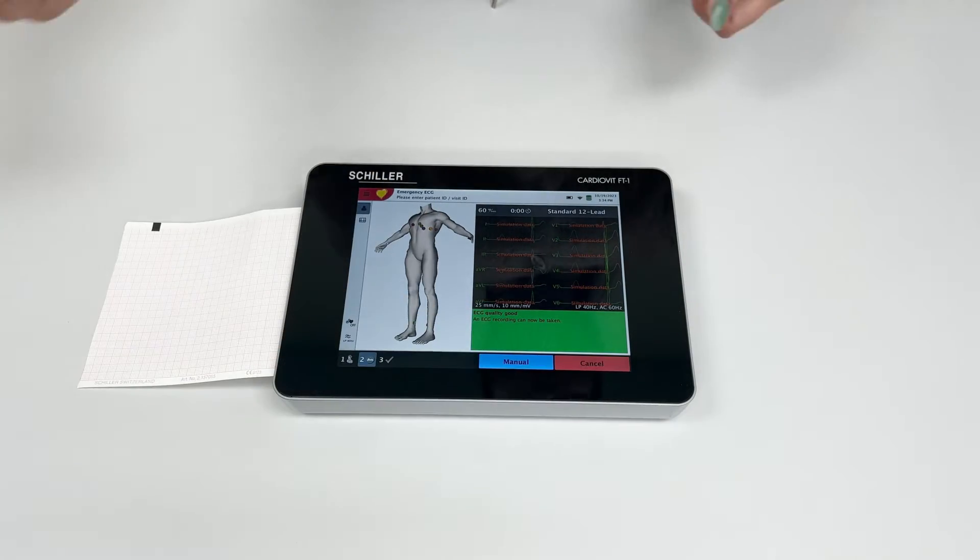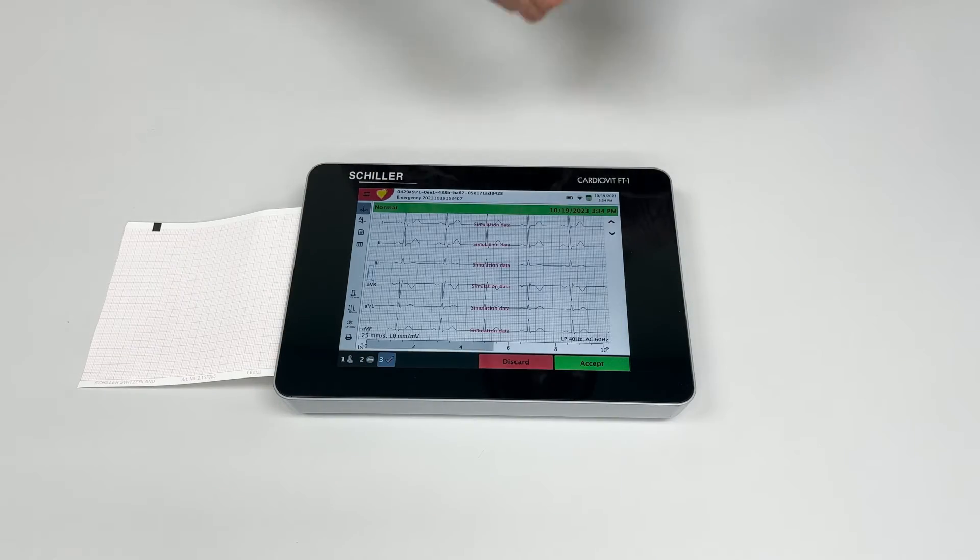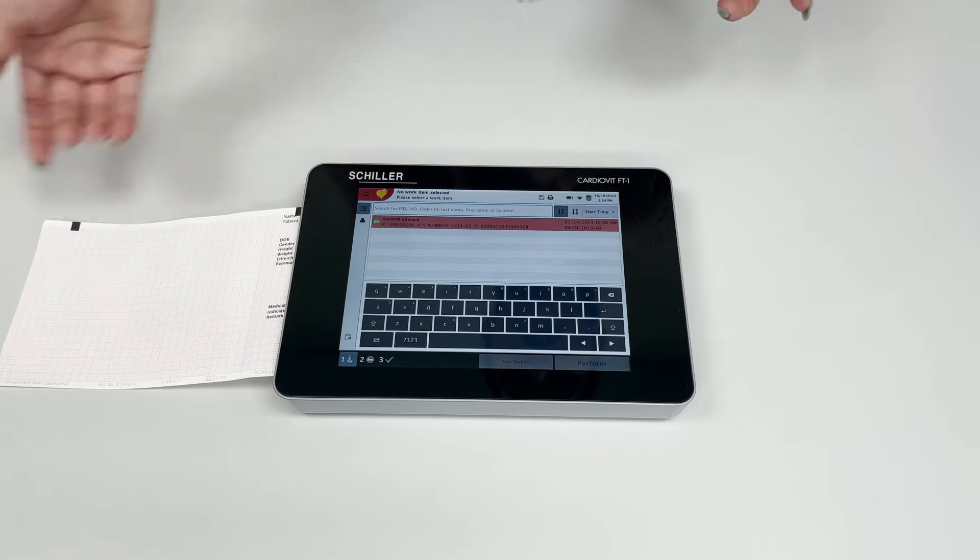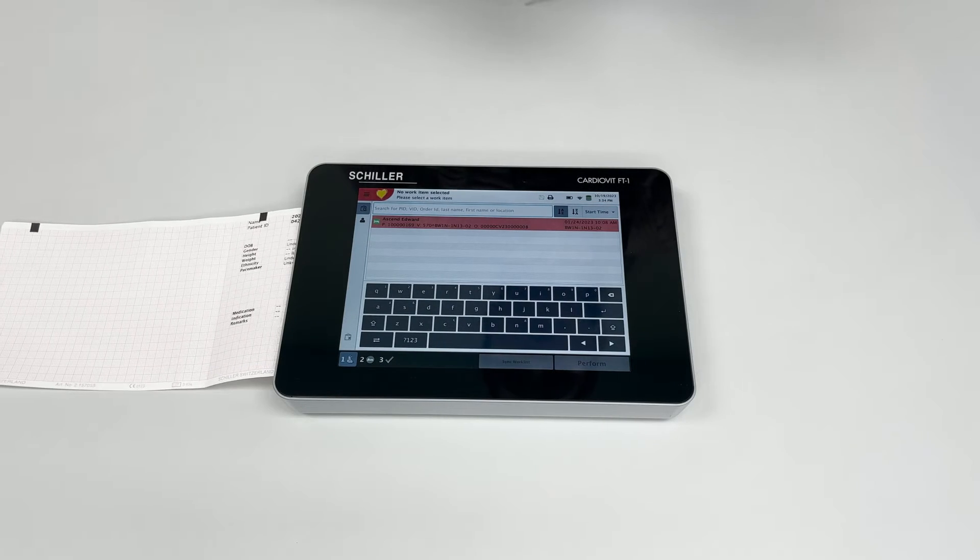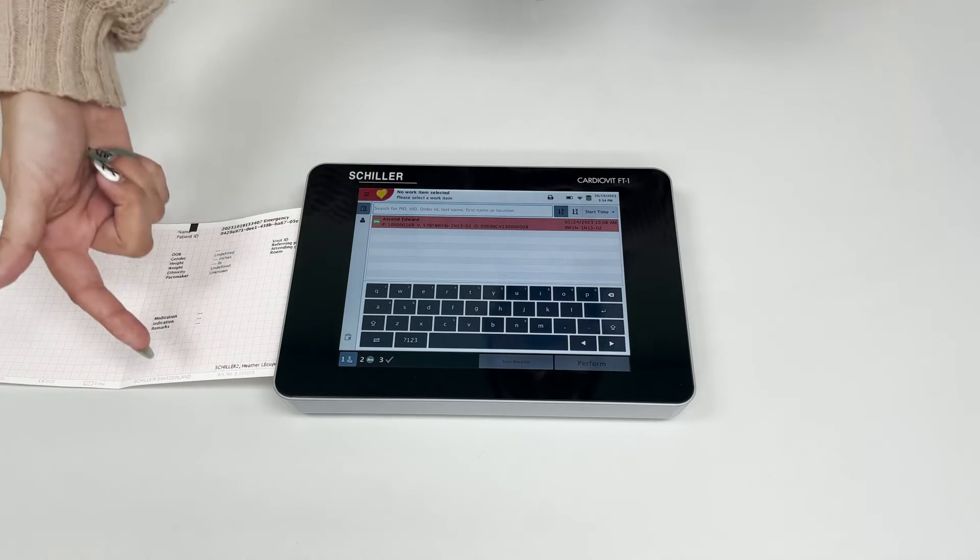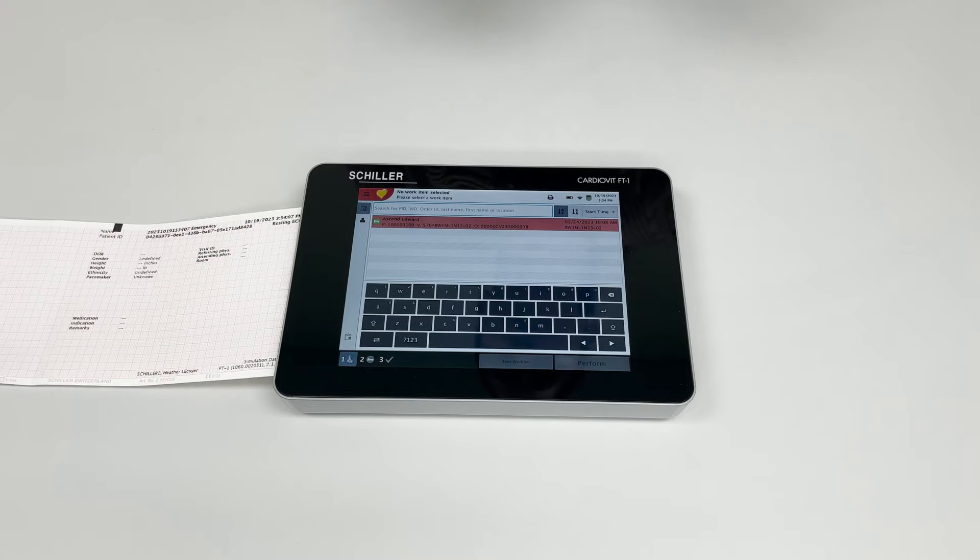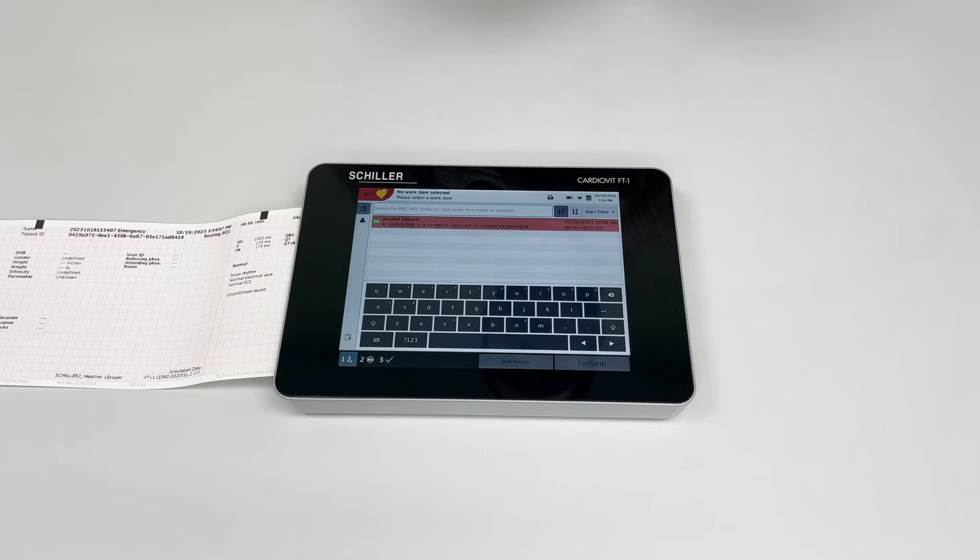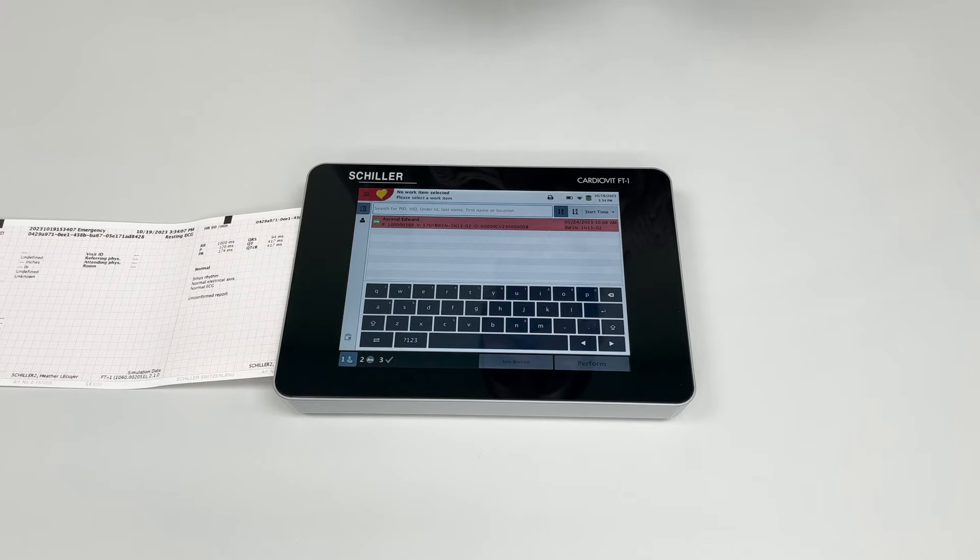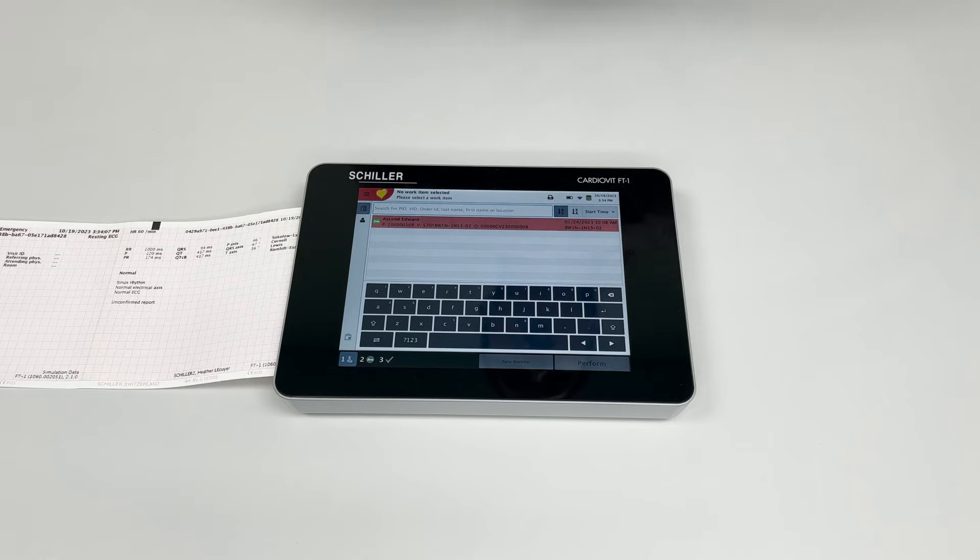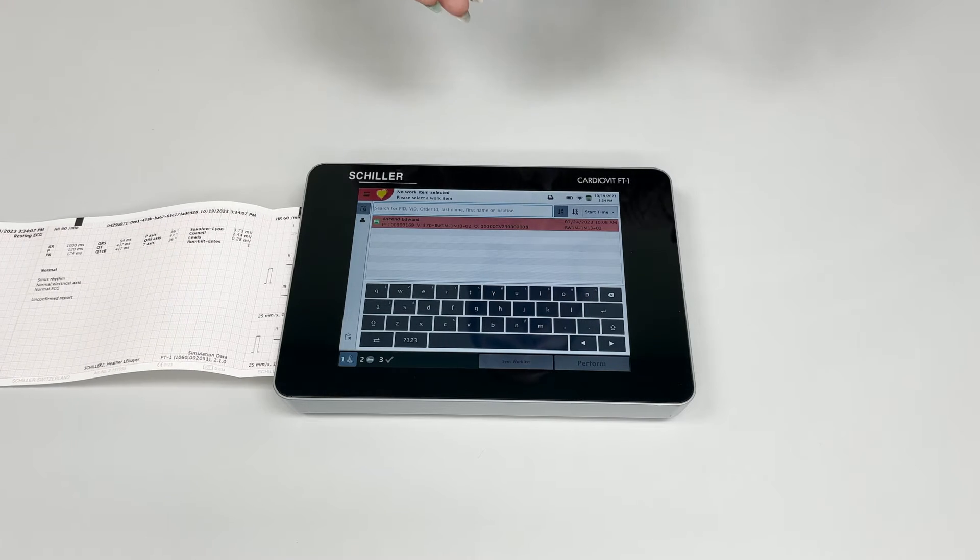As you're performing your EKG, the unit will give you your printout. You'll notice that the paper does have print. Once it stops printing, I'll show you what can go wrong if your paper is inserted incorrectly, which is actually a common problem we encounter when customers call in for support.